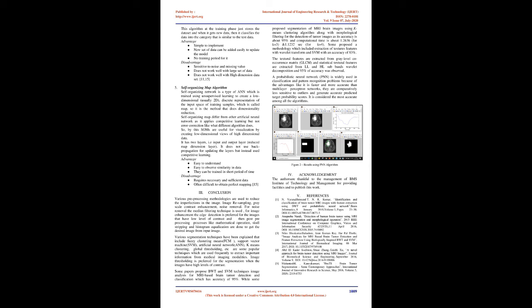The SVM algorithm is also called support vector machine. It is a supervised learning model that analyzes data using classification and regression analysis. It is a popular machine learning tool. In SVM we plot every data item as a point in n-dimensional space, with the value of each feature being the value of a particular coordinate. Then, the classification is done by finding the hyperplane that differentiates the two classes of datasets.